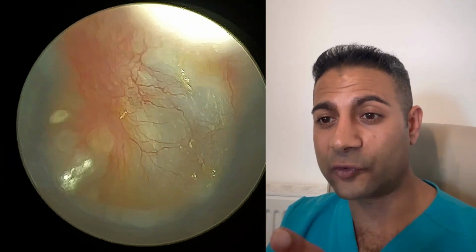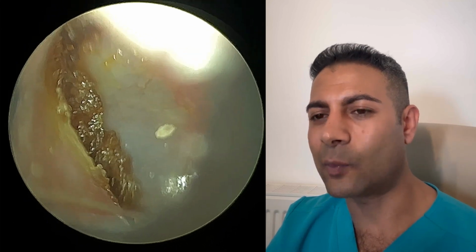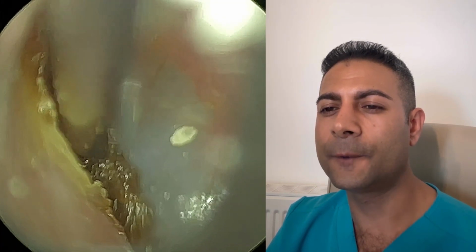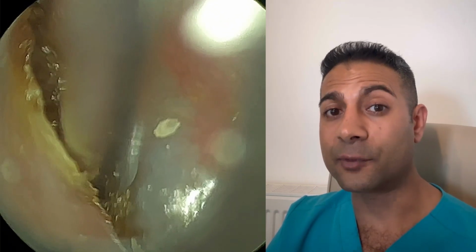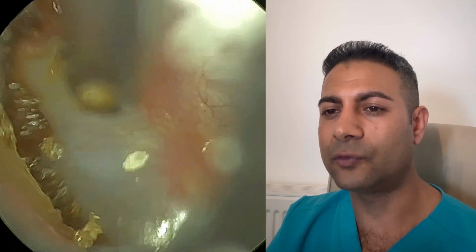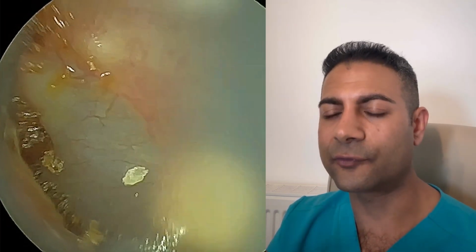So here is the smaller speculum, so you can probably see the rim a bit more than the medium size, but when you zoom in, which I probably will in a moment, so I'm just getting that wax in focus, there's less of the speculum visible. So again, we're entering this anterior recess, and I'm really stretching the patient's ear canal. The outer third is made up of cartilage, which is semi-malleable. So as long as the cartilage is not too stiff, we do have some wriggle room there. We can really stretch and straighten the ear canal. There is a limit, of course, but the bony part of the ear canal is rigid, it's solid, we can't manipulate that.